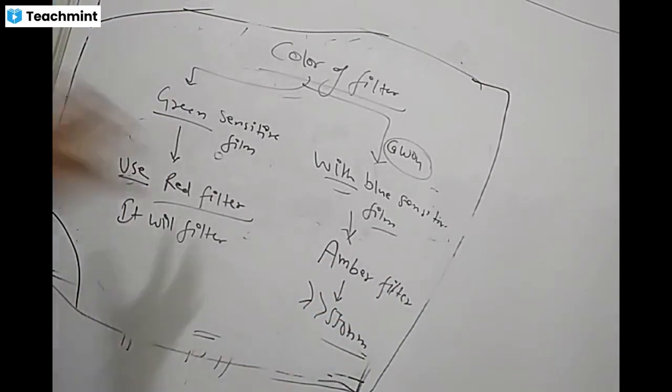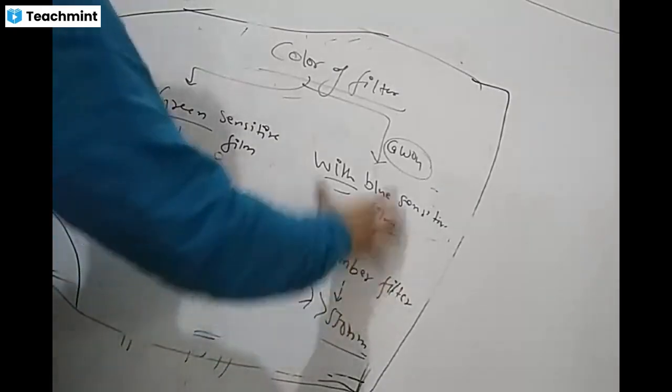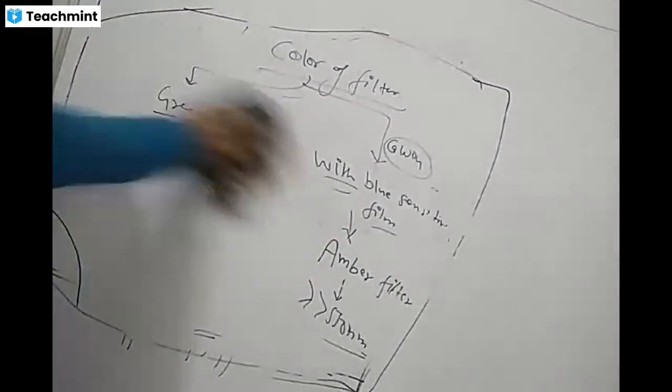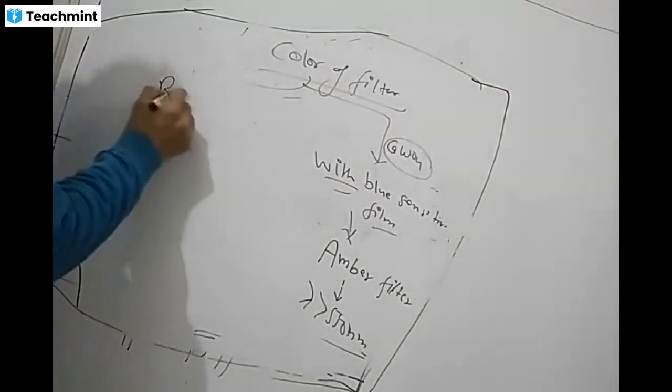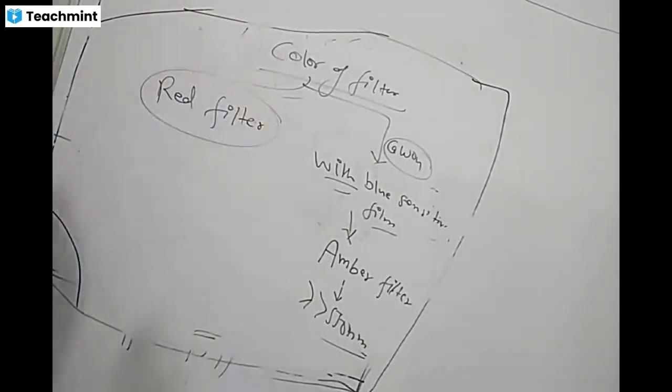But if we compare the red filter and the amber filter, amber can only be used with the blue sensitive film, but the red filter is suitable for both. That's why we are using the red color filter in a dark room.